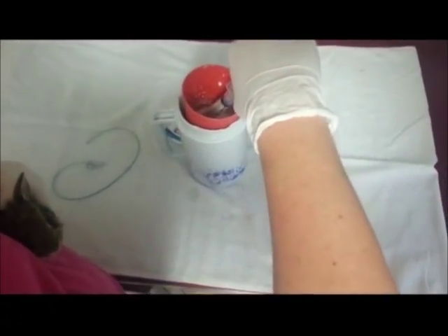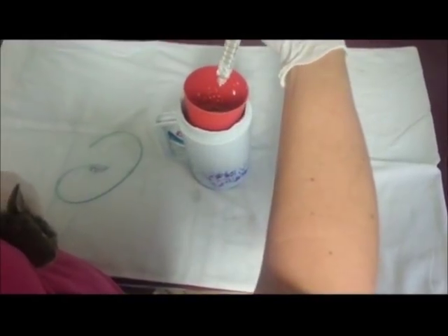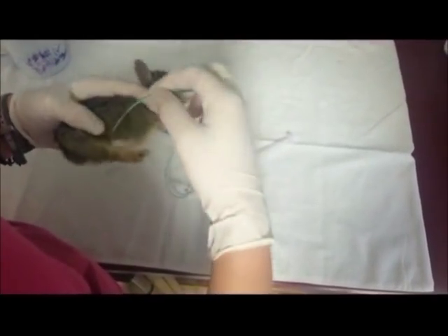To begin feeding, pull up the amount of the formula needed and make sure to get rid of all the air bubbles and push the air out of the end of the tube before you start hand feeding. Next, restrain the cottontail with its left side facing down and right side facing you. Have your dominant hand free of the cottontail to push the tube down.